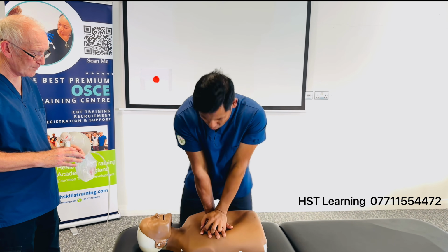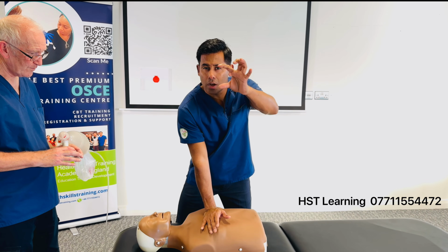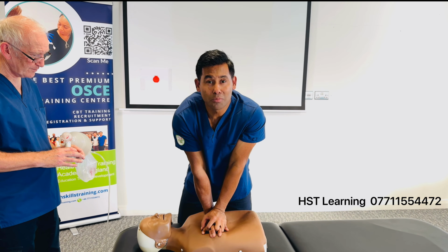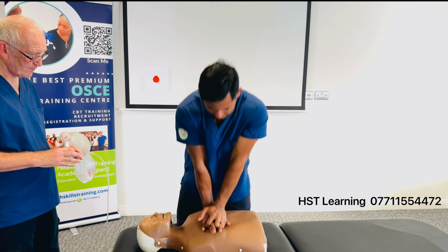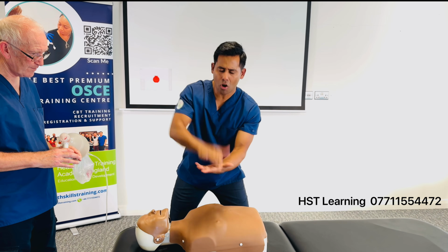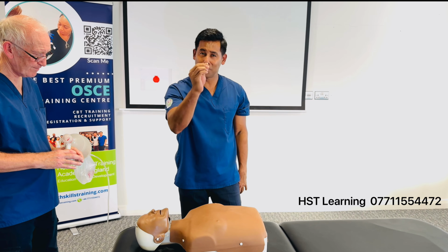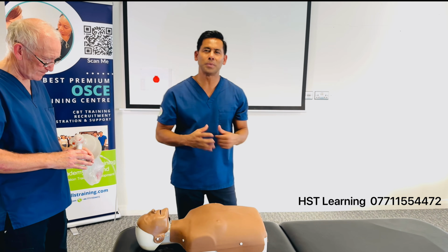So you can see here, you need to go harder. Don't worry about exactly 5 centimeters, the computer will pick it up, but your focus should be going hard and the rhythm should be 100 to 120 count. 1, 2, 3, 4, 5, 6, 7, 8. So that's the rhythm all the way, and keep it on with the rhythm until 30, and then make sure you give the oxygen.